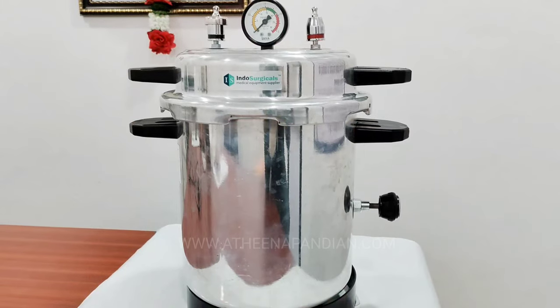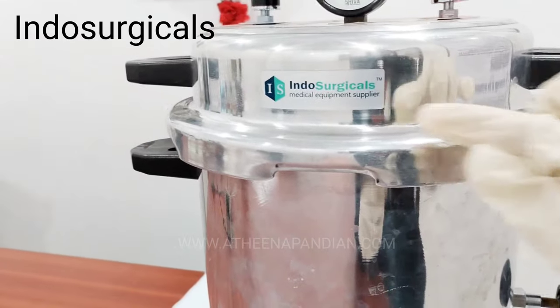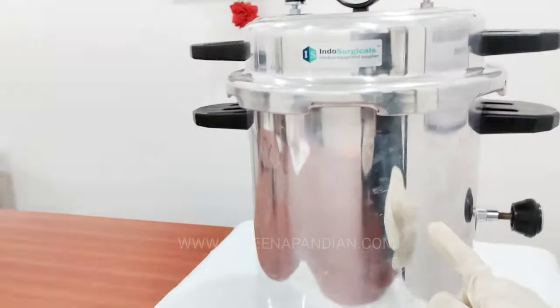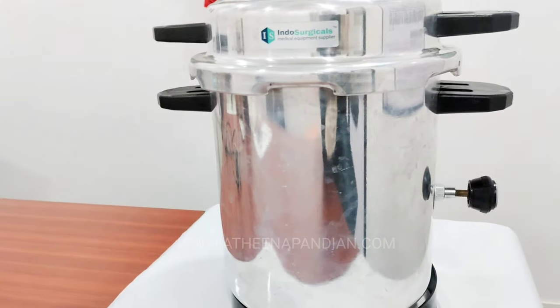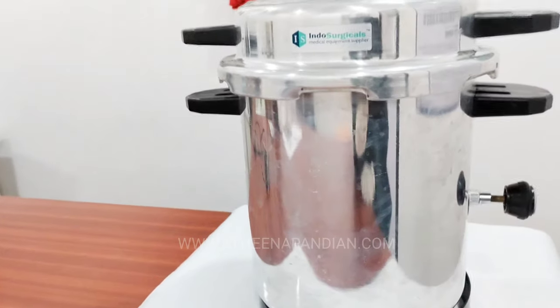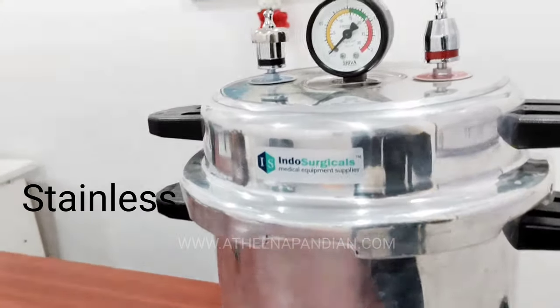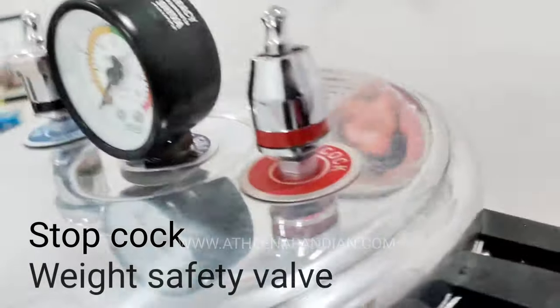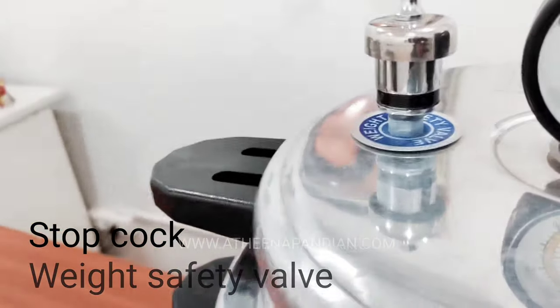So now we are going to see the parts of the device Autoclave. The brand name of this Autoclave is Indosurgicals. This is the container where we are going to place our components which are to be sterilized. It has an outer coating and inner coating of stainless material. This is the cap of the autoclave. Here you can see there are 2 valves — one is the stop clock valve and the other one is the weight safety valve.